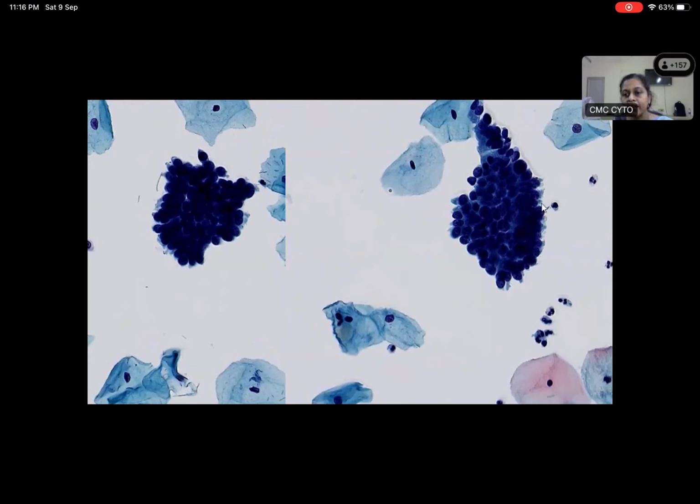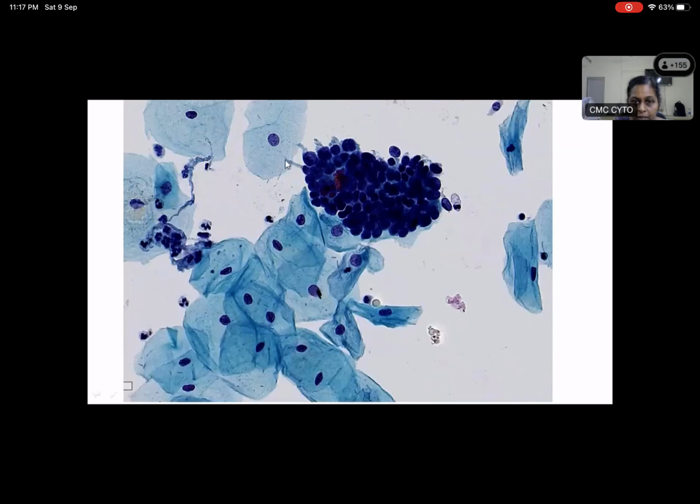So what is feathering, Saif? Ma'am, it is like a tumor diathesis, ma'am. It's in tumor diathesis? Nuclear protrusions along the periphery. Yes, so it is cytoplasmic or nuclear protrusions or tags at the periphery which are standing out. Again, you can see very nicely the protrusion at the periphery.